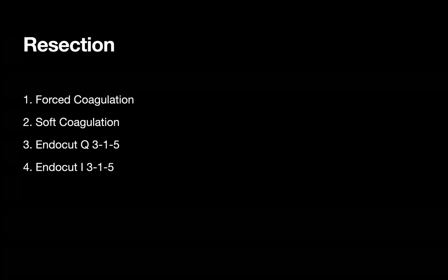Roy, you want to comment on that? Okay, what it shows is 87% picked up Endocut Q, forced coagulation 7%, soft coagulation 7%, Endocut I 0%. Endocut I basically is used for needle knife or a sphincterotome, so that's not the right answer.